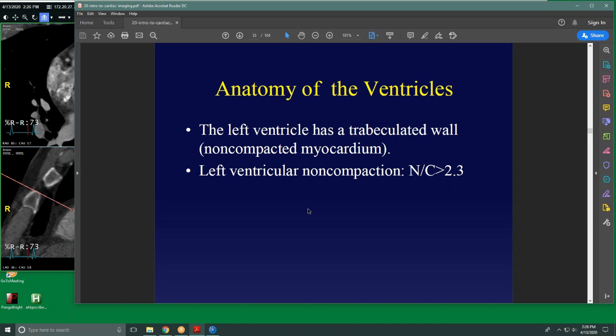So what you do is generally done using electrocardiogram. You'll measure the electrocardiogram signal, and there is a correlation generally between the electrocardiogram signal and phases of cardiac quiescence, that is, places where the heart really isn't moving very much. Generally at end diastole, right after the heart is finished filling with blood from venous return, the heart will tend to be moving the least, okay?